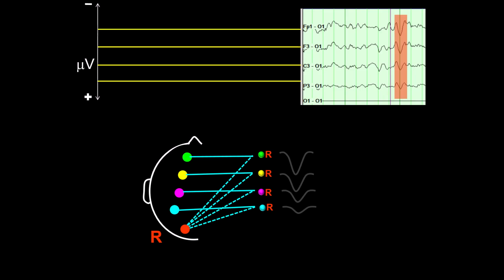The first assumption is that we are capturing all the electrical fields present, or that is the electrical field present at the scalp at the point in time the electrical element is being captured. And the second assumption is that the whole head is involved by a single field.